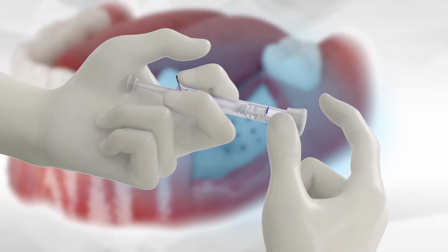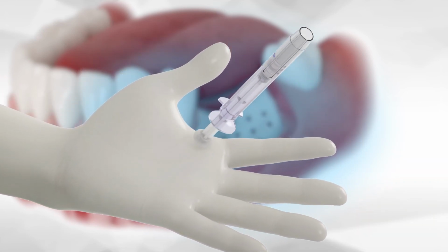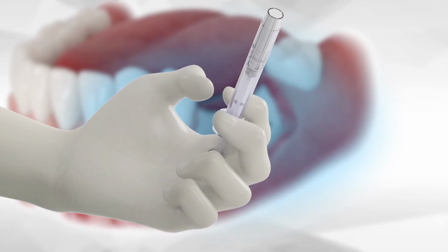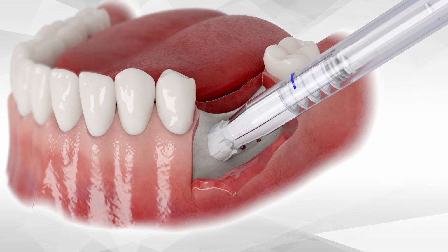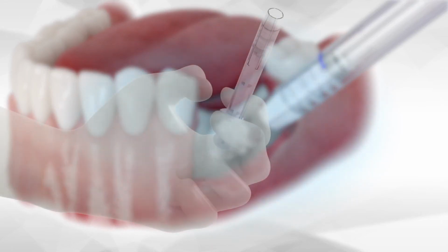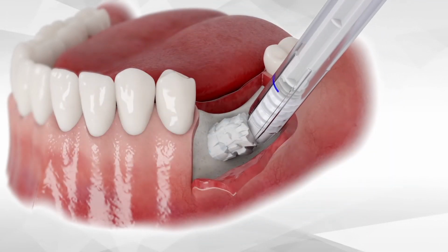Next, with a twisting and pulling motion, the cap is removed and the shaft is placed between the pointer and middle fingers, and the syringe is held as can be seen here. Approach the site in a 45-degree angle and start ejecting the cement into the site using the head of the syringe in order to stabilize the cement in place. The cement is deployed into the site until it stops, and then the position is changed to use the thumb in order to expel the rest of the cement into the site.